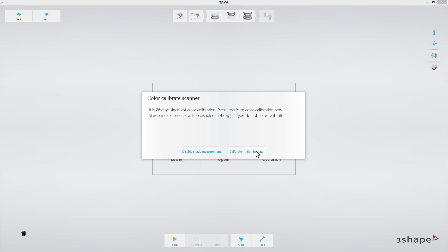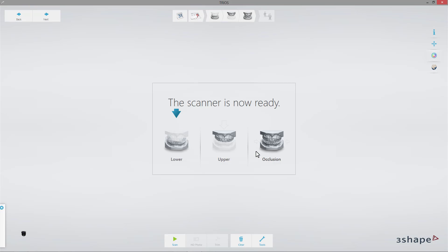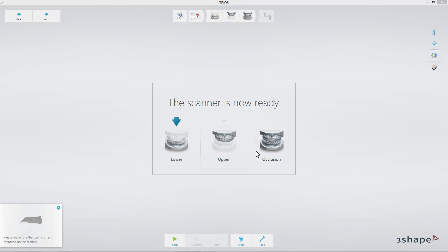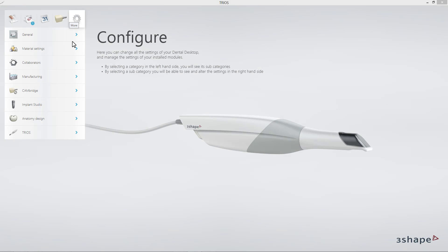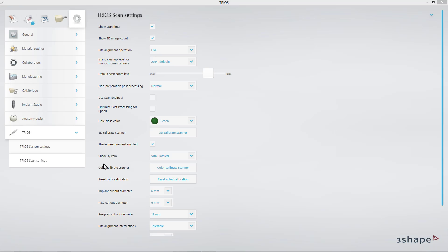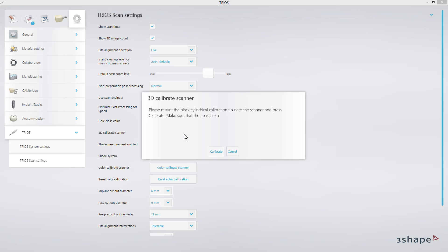I will close the messages and proceed with 3D calibration from the Settings page. I will choose TRIOS Scan Settings and select the button 3D Calibrate Scanner.